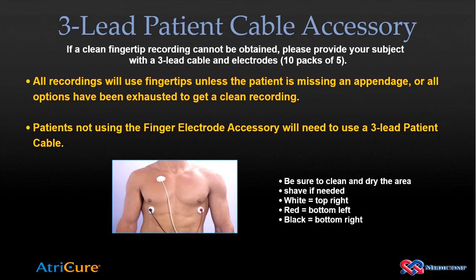Once the areas are shaved, wash them with ordinary soap and water. Try not to use soaps that contain lotions or oils. Then dry the locations thoroughly. It will be easiest if they snap the wires onto the electrodes first and then apply them to their chest.